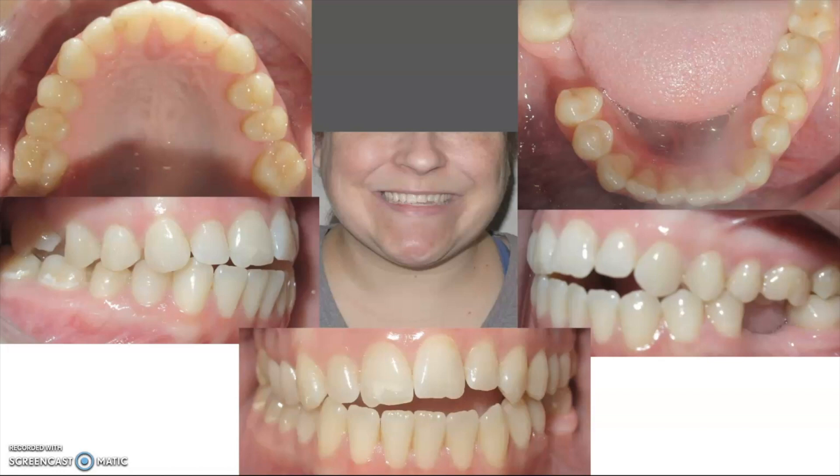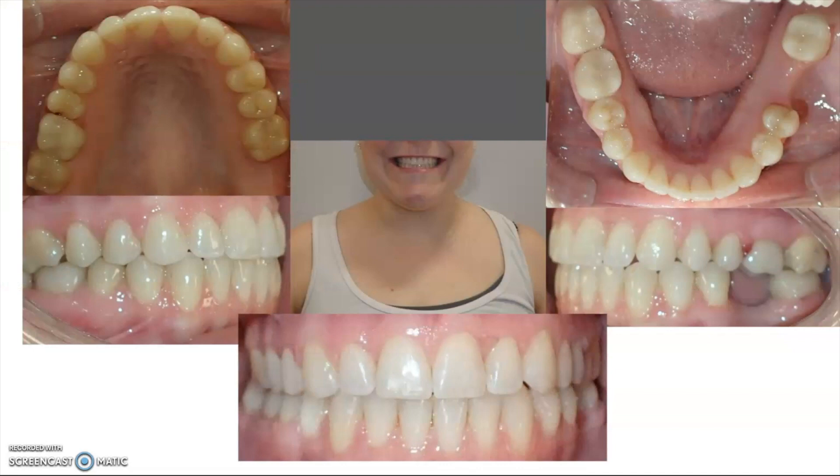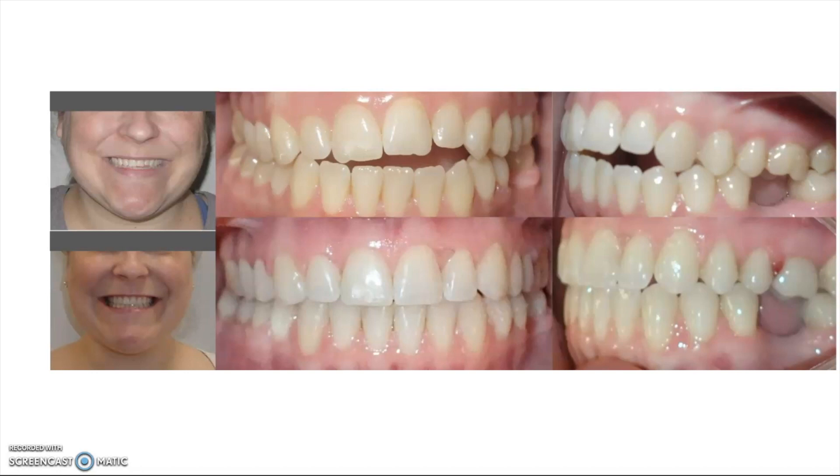Back to our patient — you can see she has that very strong open bite, and her smile slants up to the left, which is where her tongue tends to go. For her, we used habit reminders, gluing those little spikes behind the teeth on the left side, mostly on those three teeth. We also did braces and had her wear rubber bands full time, day and night. She was a very cooperative patient, and after about 18 months we were able to get her bite fully in contact. The bite looks great — everything was nice and straight.